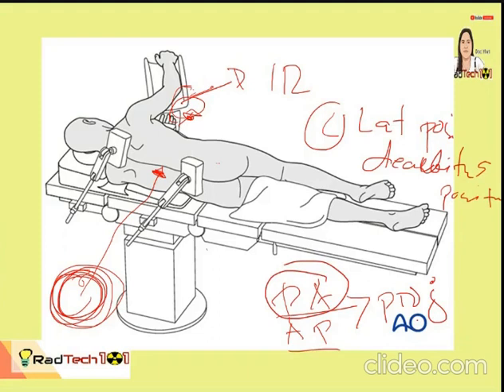It's a left posterior oblique. It's not oblique, it's decubitus. Left posterior decubitus. So, for example, your answer is left posterior decubitus. That would mean the X-ray passes through the left posterior of the patient. So is that the case?